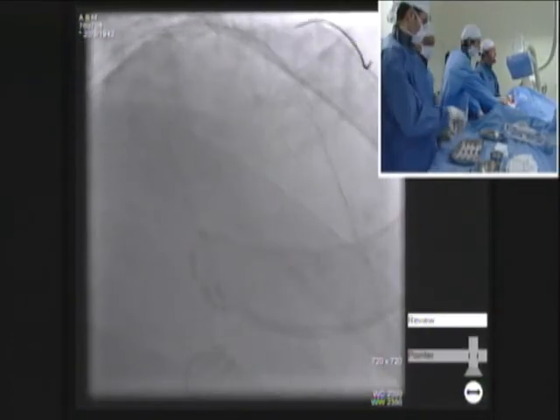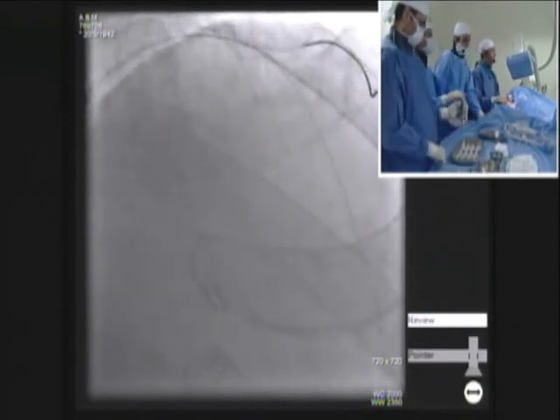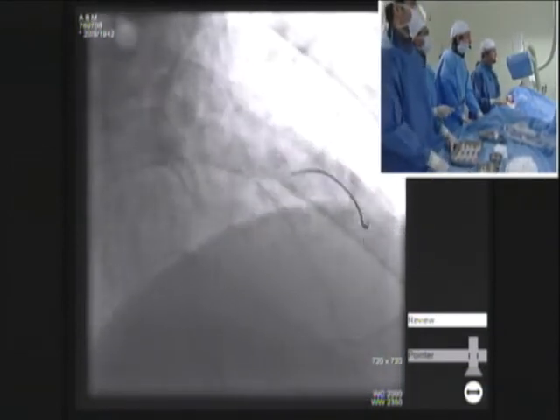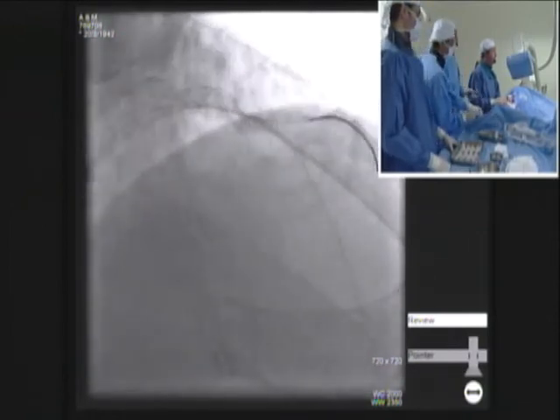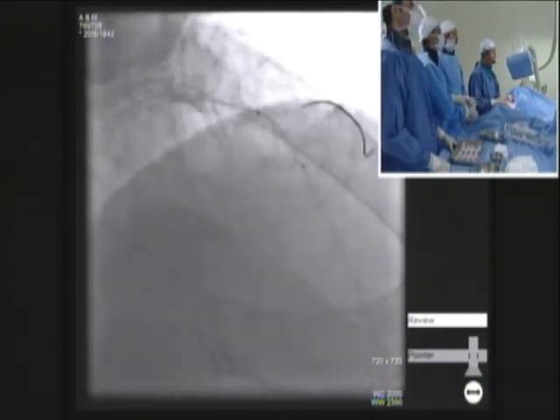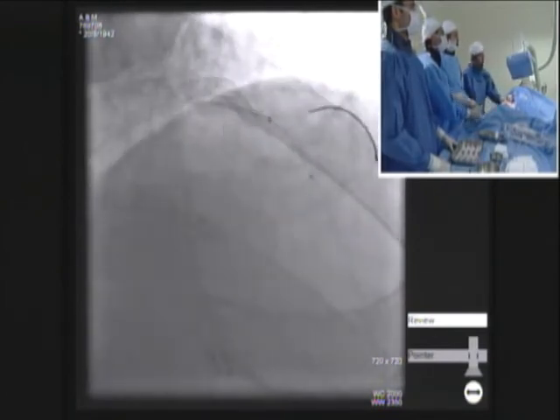Yeah. I'm pretty much convinced that with Medina 010, I'm gonna try provisional. It's a favorable angulation if I need to do a T-stent afterward. So I will start. I would like to see your comments regarding the lesion preparation. Do you think we should predilate or can go for direct stent in a case like this?